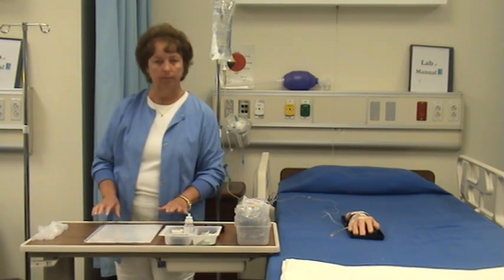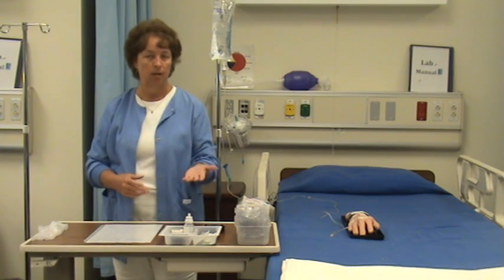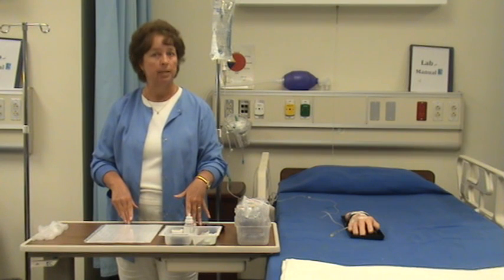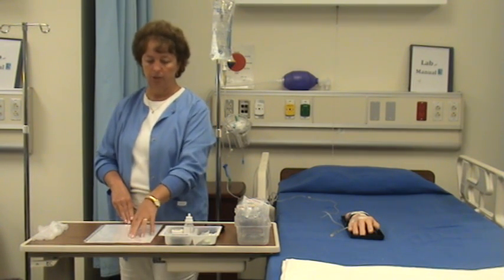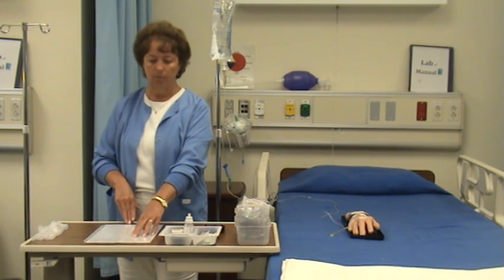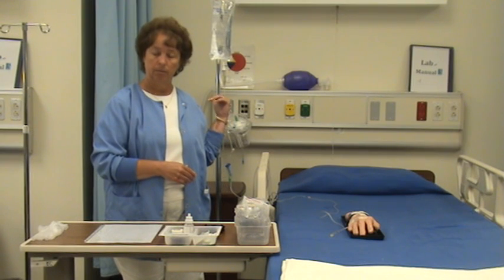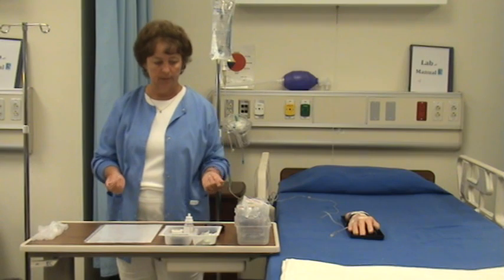So the first thing I want to do is look up my medication and find out all the things you need to know about any medication, the action, side effects. Important with an IV piggyback, you need to know how fast you're going to administer the antibiotic. And we've determined that the SCF is going to be given over 30 minutes. And the second important thing is if you're going to give it through an existing IV line, is it compatible with the medication, the primary IV line? And we look up compatibility and find out that yes, it is compatible.